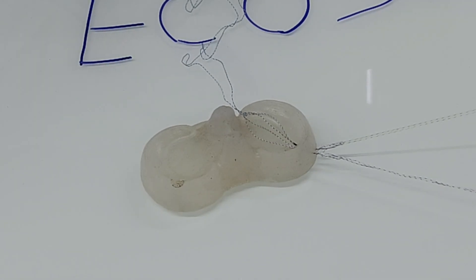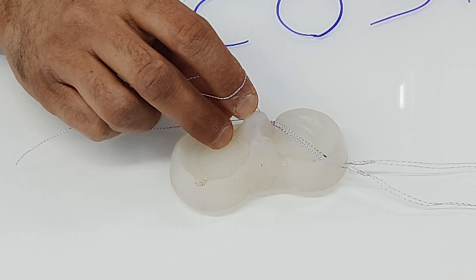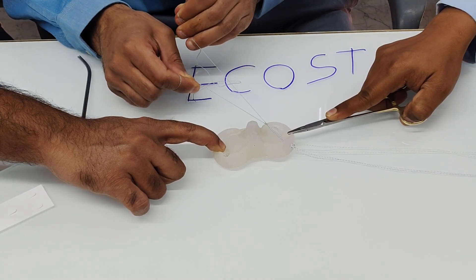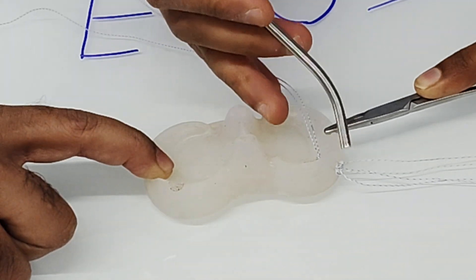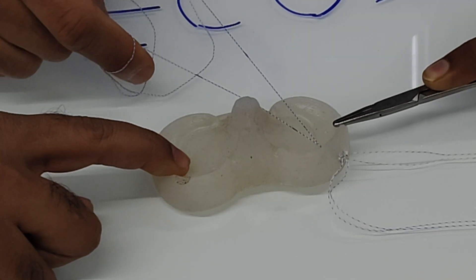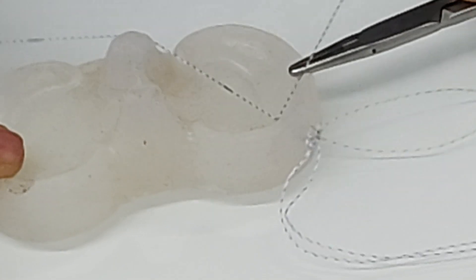Once you are satisfied that the anchor has penetrated the capsule, ask for a knot pusher. Hold this part and cinch it. You can see that as we cinch the thread, the anchors deploy on the posterior part of the capsule. Both anchors deploy nicely and become like a flower on the posterior part of the capsule.